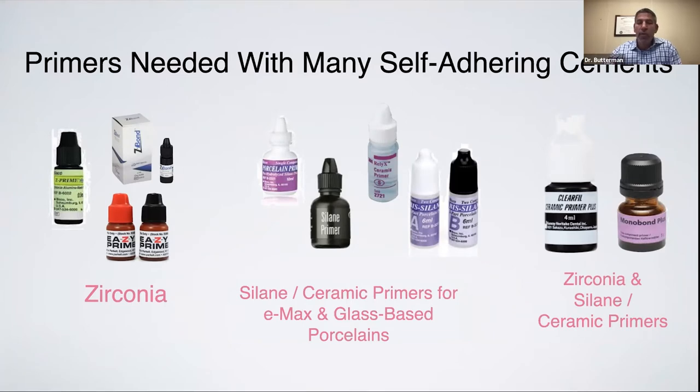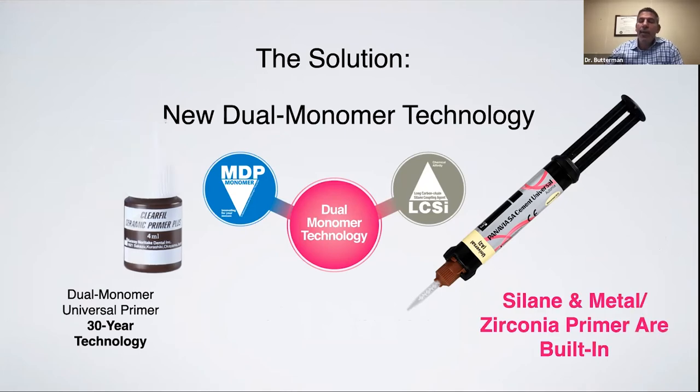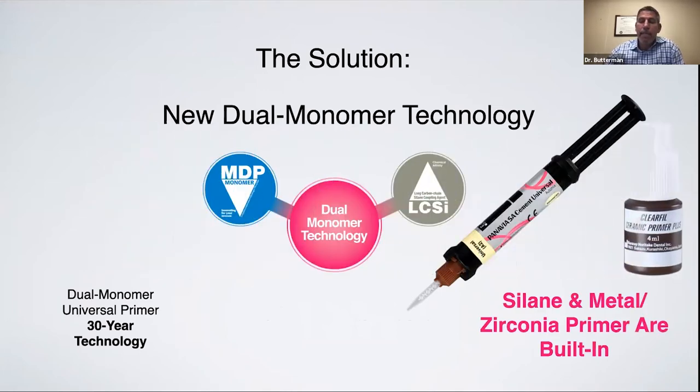There are zirconia primers, and there's silane for glass ceramics. We now have new materials that combine our zirconia primers with our silane for glass ceramics, and things are getting easier and easier. The reason the cement is called universal is because it takes our zirconia primers, our glass ceramic primers, our dentin and enamel primers, our MDP and our LCSI, and instead of putting them in a bottle, it has mixed and combined them into the cement. That becomes pretty interesting, because all of those steps, those room for mistakes and error that we had, this is going to correct a lot of that, because it's just mixed in with the cement.